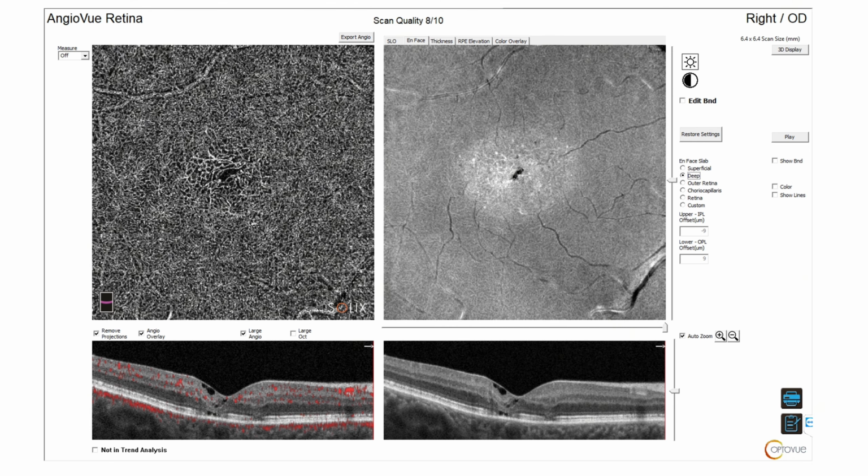So, Julie, the beauty of the OCTA is that we can get different cuts of different sections of the retina. We can get the very inner portions of the retina. We can get that middle bundle of the retina. We can get the outer segment of the retina. And we can also go into the choriocapillaris as well. Give us highlights on where you're looking for macular telangiectasia. Where and what cuts are you looking at those scans in with the OCTA?